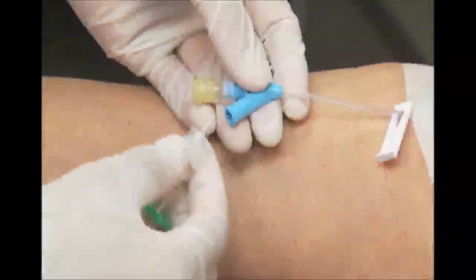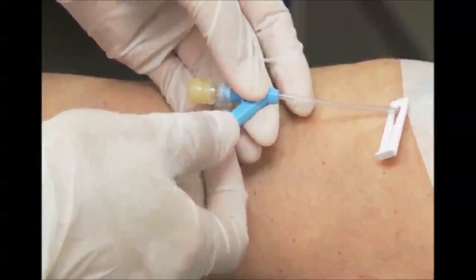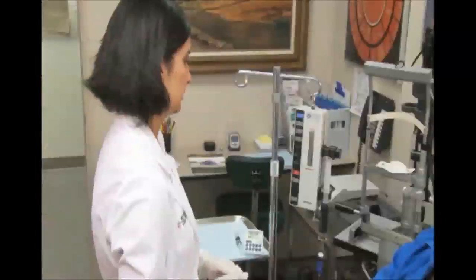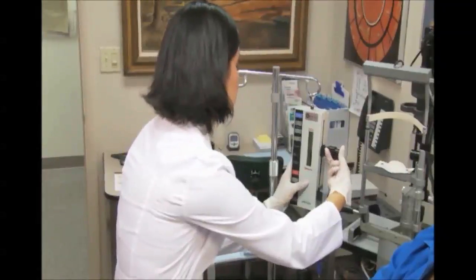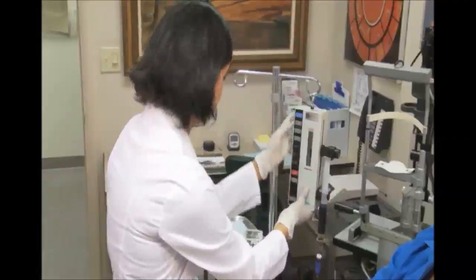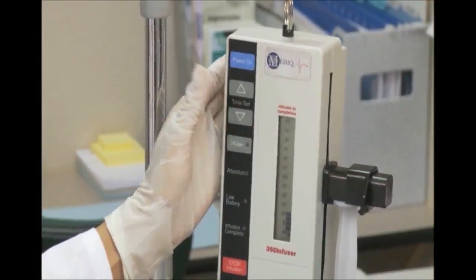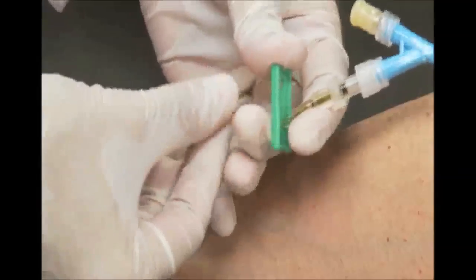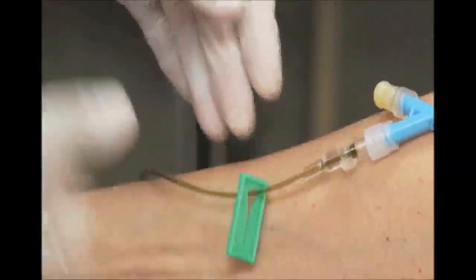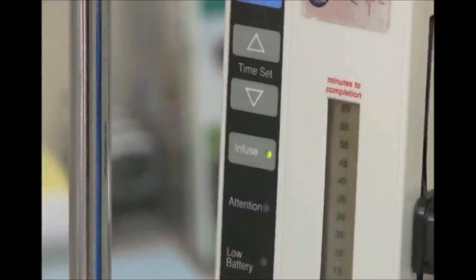To start the Visudyne infusion, connect the catheter line to the IV extension set and load the 30 mL syringe containing the mixture of Visudyne and D5W into the infusion pump. Set the infusion pump for 10 minutes, running at a rate of 3 mL per minute. Now unclamp the tubing, start the pump and begin the Visudyne infusion.